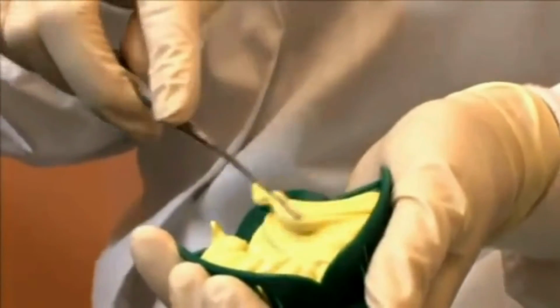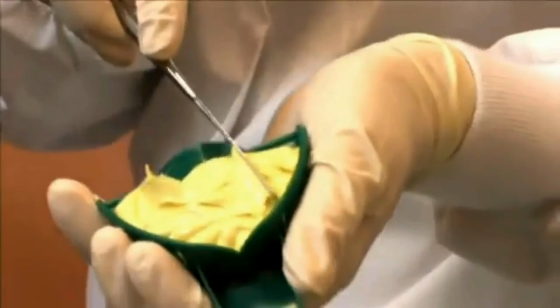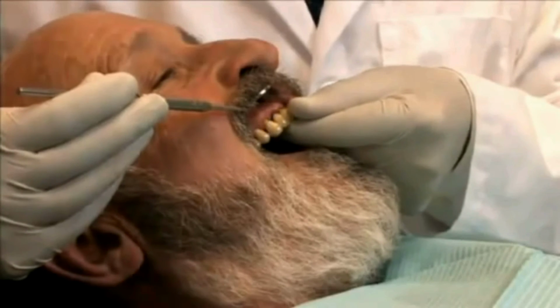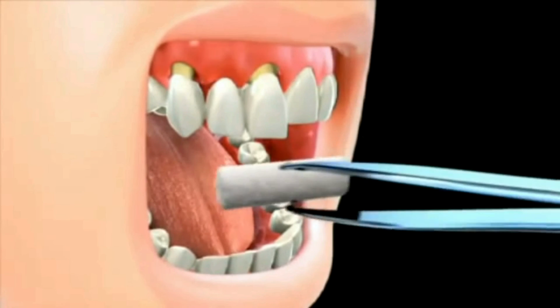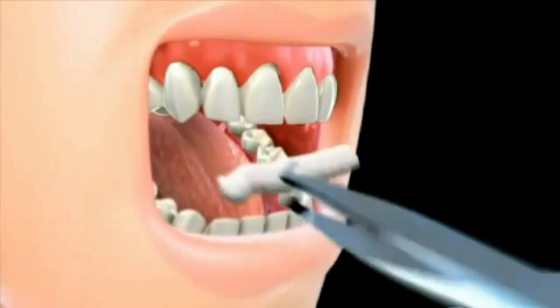Next, an impression of the abutments or the supporting teeth is made, so a dental laboratory can custom fit the bridge. Finally, a temporary bridge is inserted to protect the abutments as well as the space between them. In most cases, on your second visit, the permanent bridge is placed and adjusted to ensure it is satisfactory. Your dentist will proceed with permanently cementing it into place.